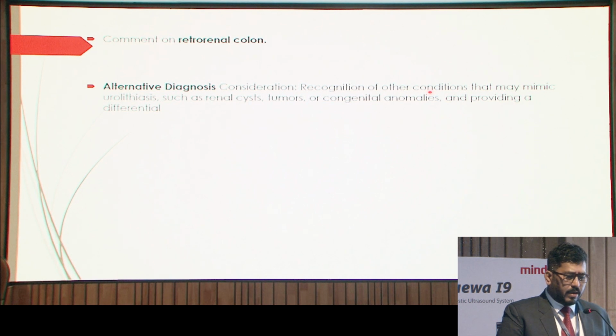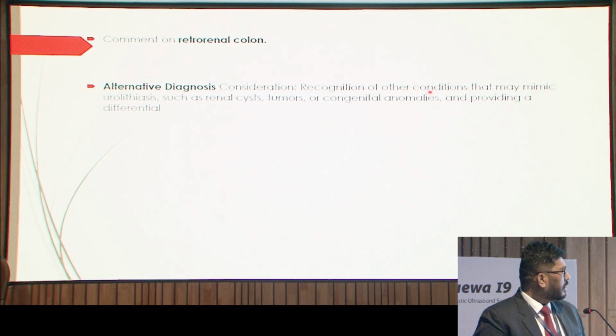Then any other alternative diagnosis, if it is there, that should be mentioned. Renal cyst has to be properly mentioned, because again, we do a puncture from skin to cortex, so a cyst can come in between our puncture, so that has to be properly mentioned.